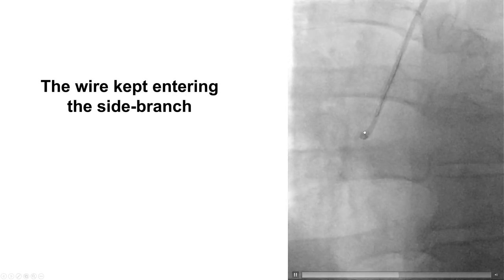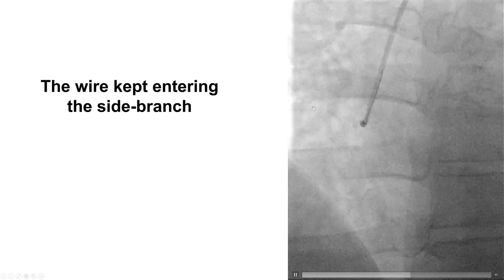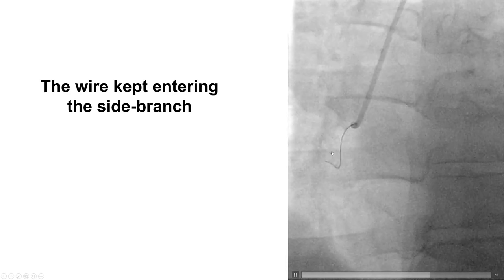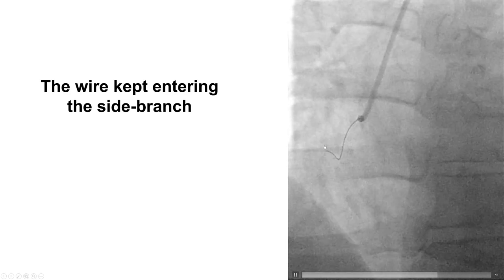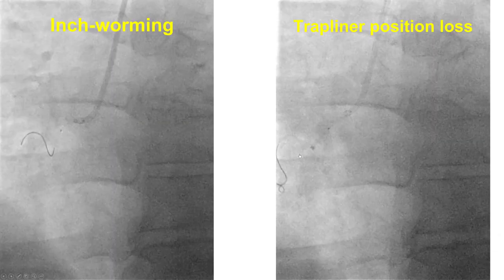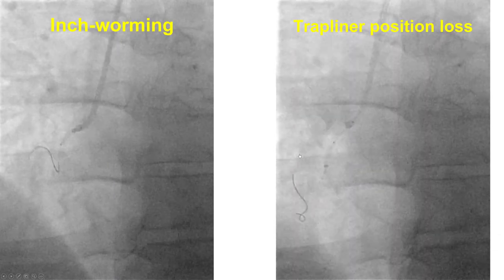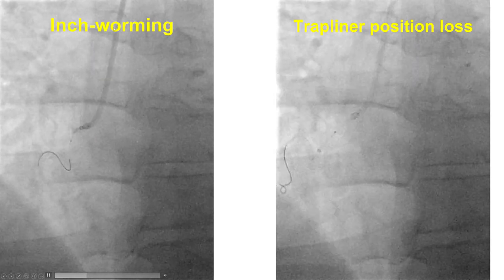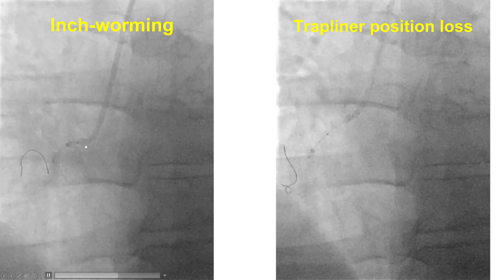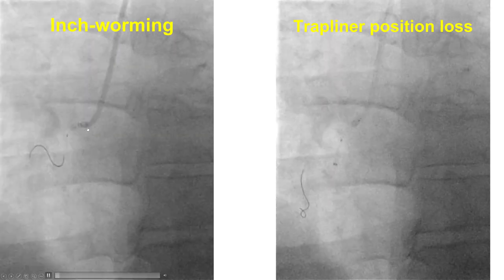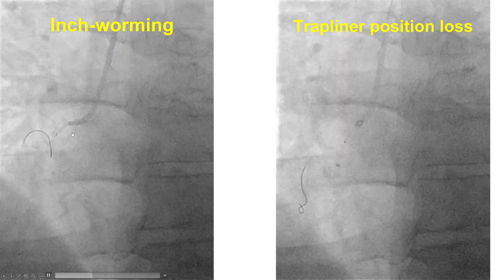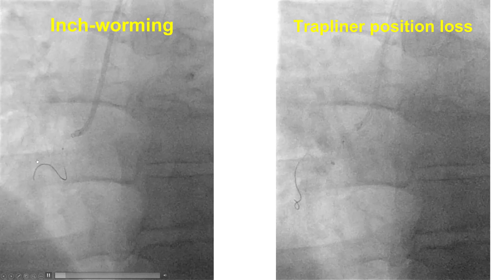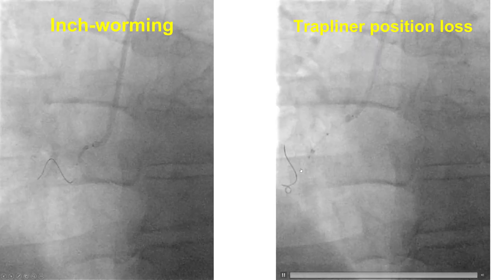We also had difficulty wiring. Engagement was not perfect and the wire kept entering the marginal branch. But eventually, by moving the guide catheter and redirecting the guide wire, we were able to advance it into the proximal right coronary artery. Knowing that support was going to be poor, we tried to reinsert the Trapliner using the inchworm technique. This was very challenging and took several attempts, but eventually we were able to inflate the balloon partially in and out of the guide extension, deflate the balloon, and the Trapliner did go down into the right coronary artery, providing strong support.